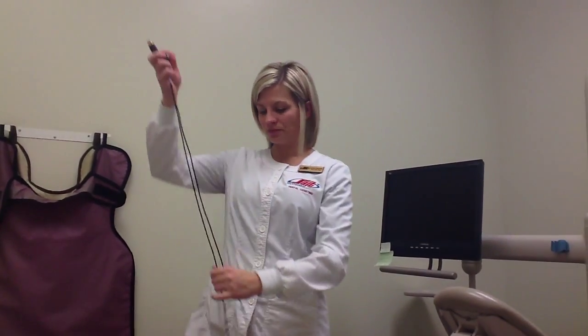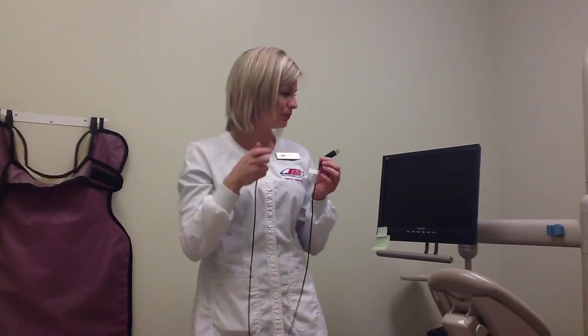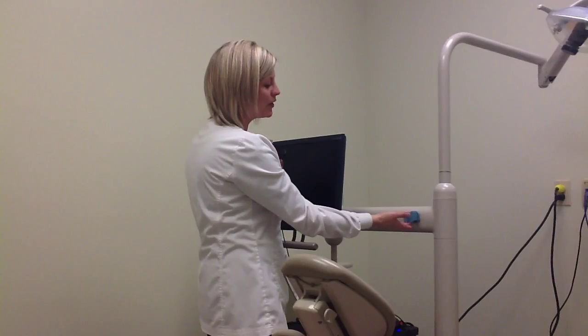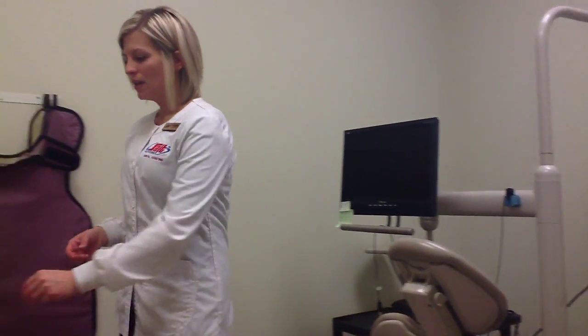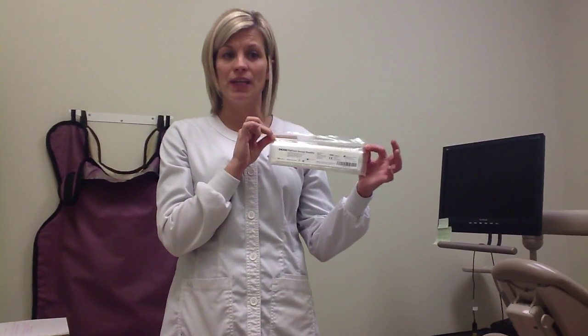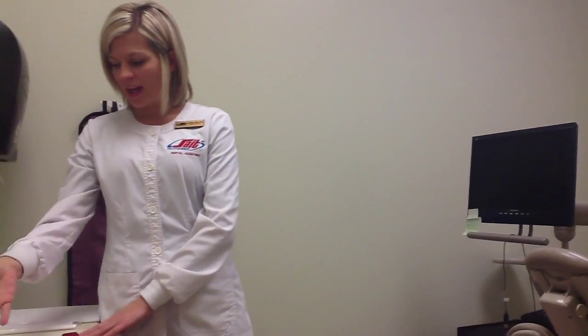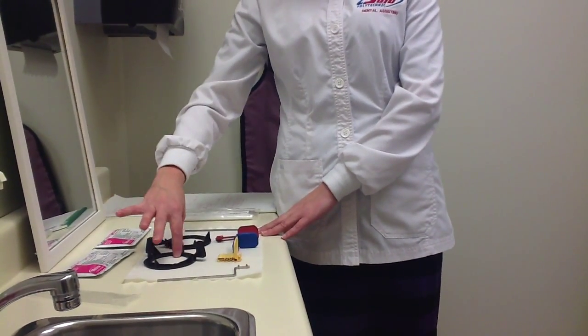Here we have a digital sensor — this is the Dexis brand, which we use at SAIT. We have three components: the digital sensor head, the cable or cord, and the USB connection that goes directly into the computer. We also have a caddy or holder — a garage for our sensor head — to help keep it safe. We'll also be using a barrier, also called a sensor sheath, which is specific to Dexis. And we have our XCP kits, which are also specific to the Dexis brand — they are the ones with the black rings.